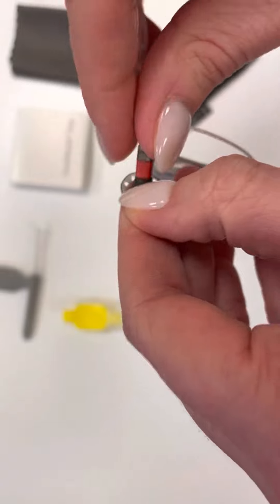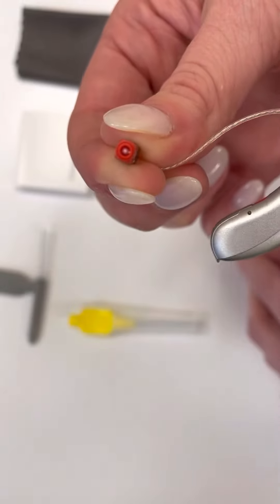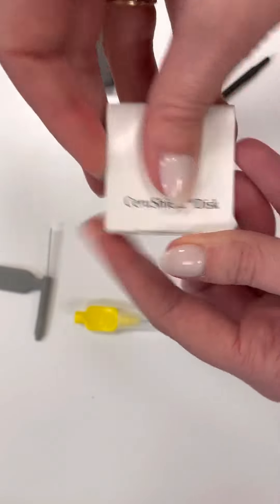Then you could take this part off. The dome comes off and in here there's a teeny tiny little white filter. So for this specific hearing aid, you use this CeruShield disc.